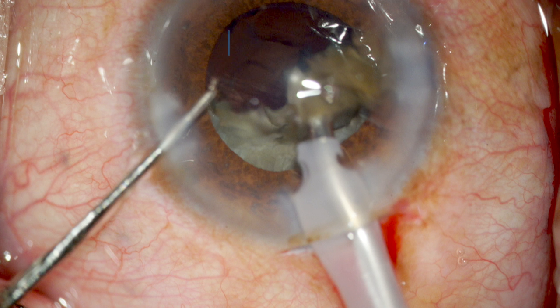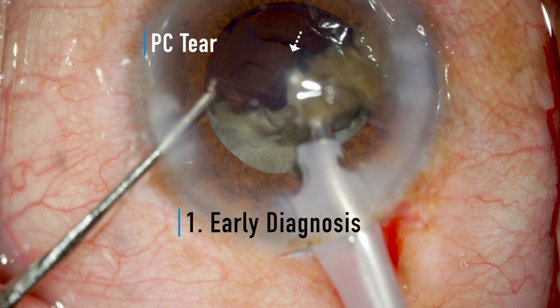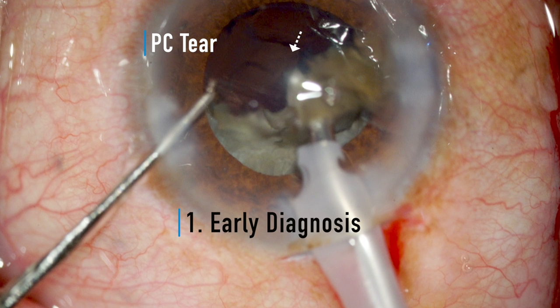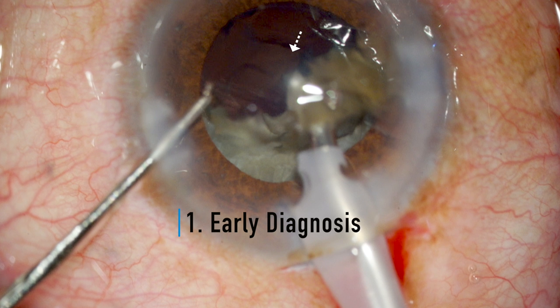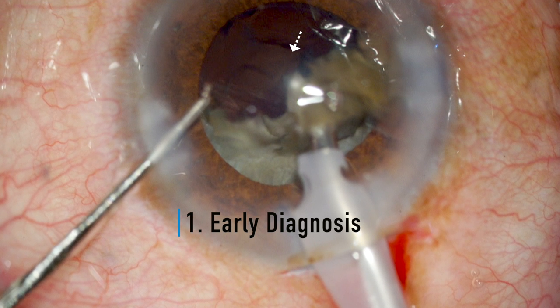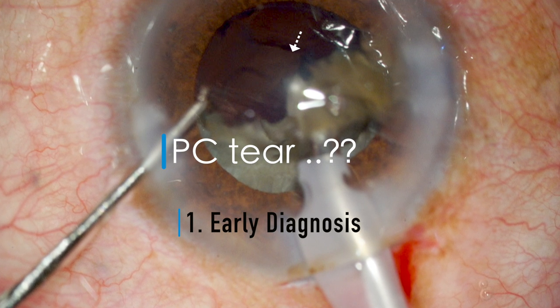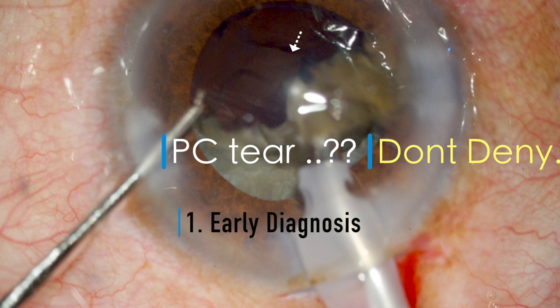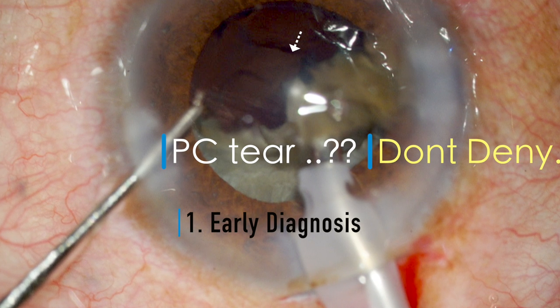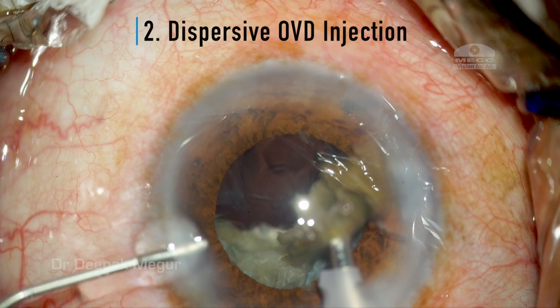To address these three goals, I prefer to stick to five rules in the event of a PC tear with nucleus in situ. Rule one: early diagnosis. This is probably the most important and also the most difficult one, because the PC tear is difficult to appreciate due to the overlying nucleus obstructing the view. Subtle changes in anterior chamber dynamics should warn us. When in doubt, always err towards the diagnosis of PC tear.